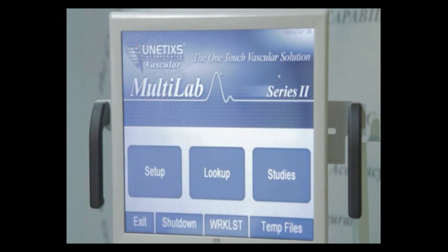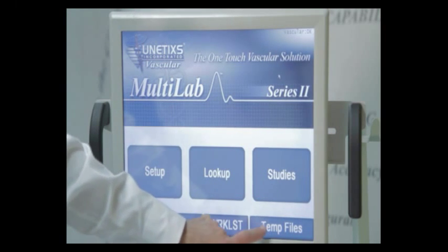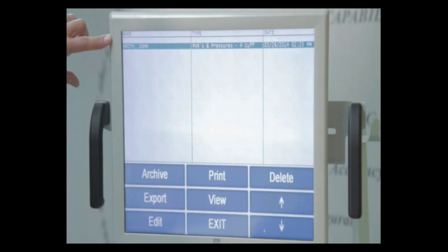Since we're on the topic of unforeseen circumstances, let's say you're in the middle of a patient study and the power suddenly goes out. Your multi-lab instrument is set up from the factory to automatically resume when the power is restored. What will happen when the power comes back on is that your instrument will come up to the multi-lab start screen as shown. If you want to resume your study, simply press the temp file button in the lower right-hand corner, and you'll see your patient displayed on the screen here.